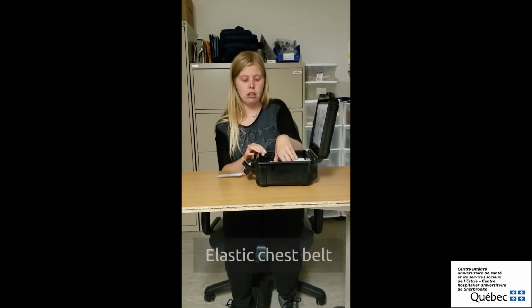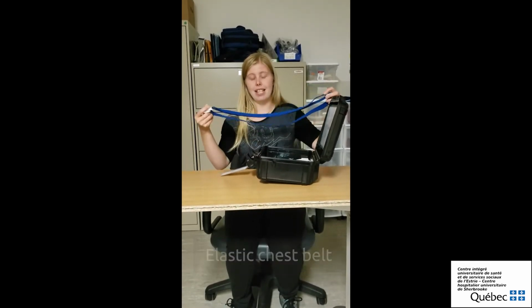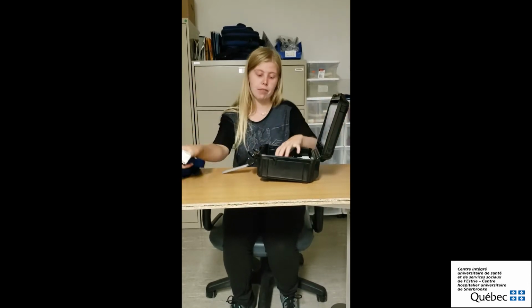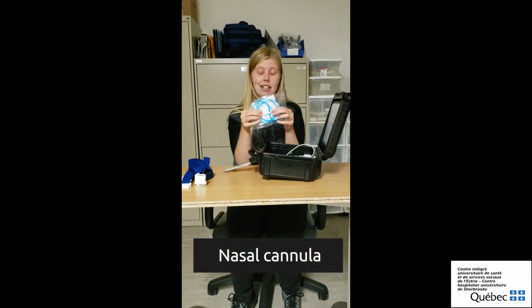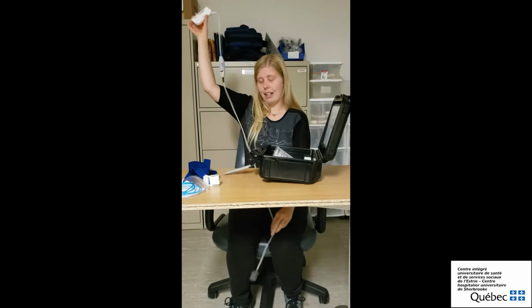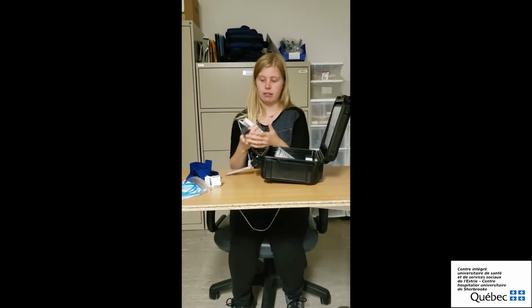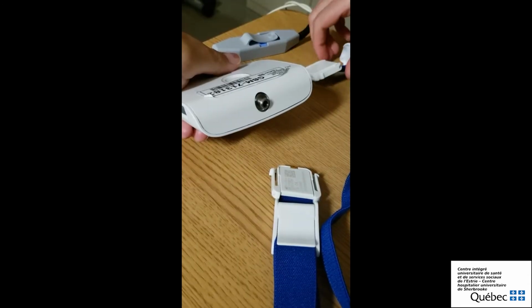You'll find an elastic band that you can adjust yourself to go across your chest. A nasal cannula to put in your nose, as well as the oxygen saturation sensor that is connected to a small machine that will record all the information gathered during the night. Let's look at the machine more closely.